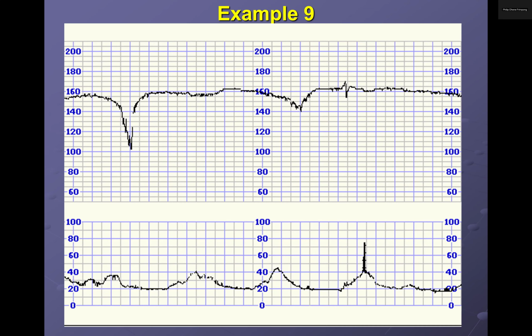I would take a scan. Very good, Philip. Excellent. You need to do a scan, exactly, because you can't just say, okay, I'll do a cesarean section. She's still 31 weeks, right?